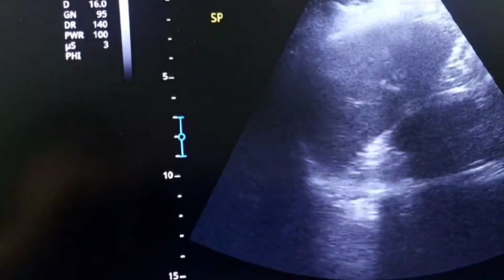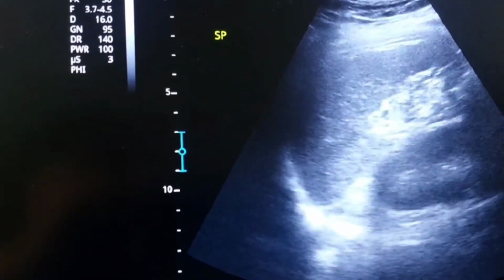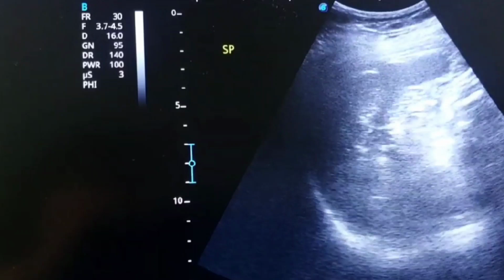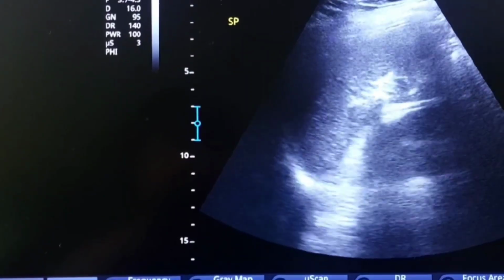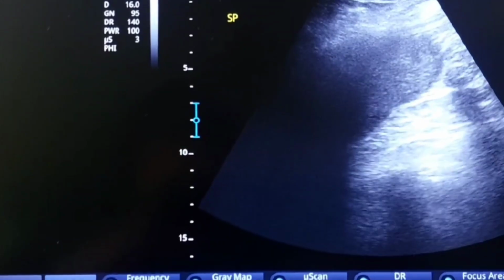As you already know, there are multiple congenital varieties of the spleen, varying from asplenia and polysplenia, which in this case you are able to see, and also splenogonadal fusion can be seen, and wandering spleen. So this is the case of the polysplenia on the ultrasound imaging.